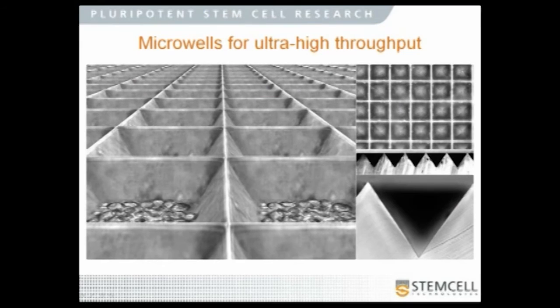So having established conditions under which we could reliably form aggregates from single-cell ES suspensions, I then looked at ways to really increase the throughput dramatically. And after looking at a number of different potential approaches, I wound up developing this microwell technology that has become the AggreWell. So just some graphics here to show you visually how the system works.